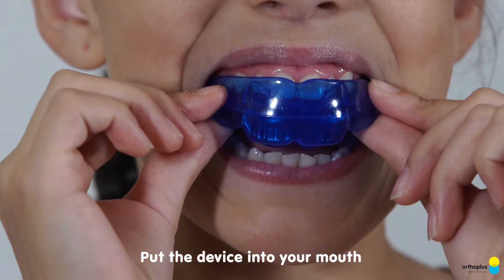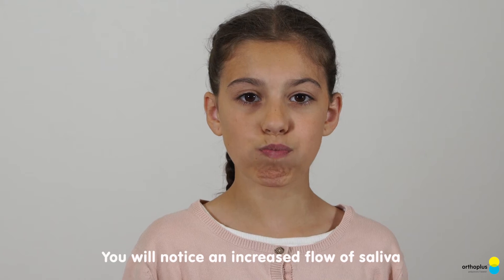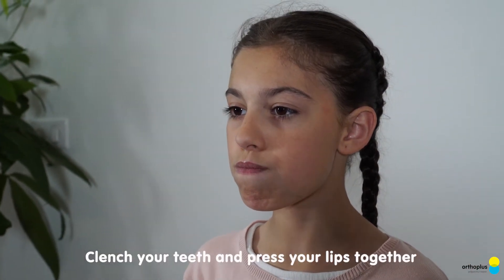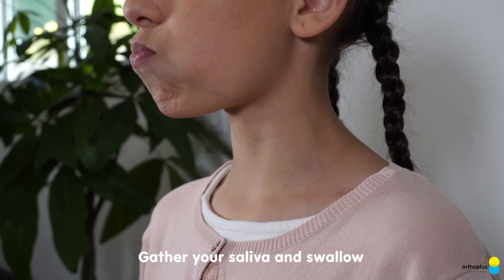Put the device into your mouth. You will notice an increased flow of saliva. Place your tongue against the roof of your mouth. Clench your teeth and press your lips together. Gather your saliva and swallow.